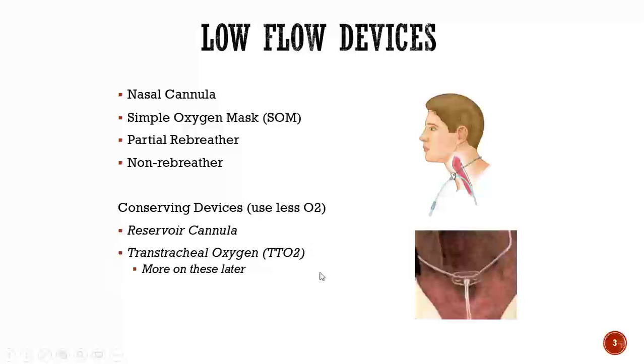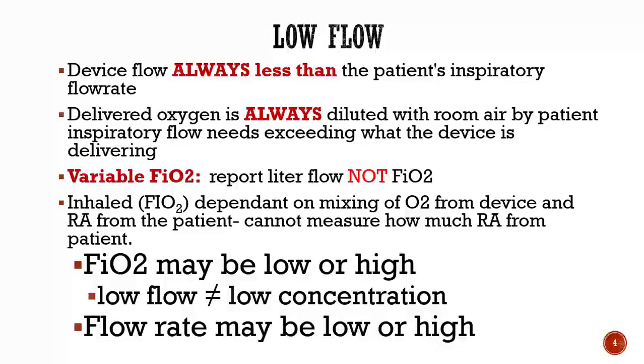Know that there is very, very little on this. I'm not going to ask you about it. This is a very low use device. It's one that still comes up every once in a while for a patient that comes in. I've seen it, but not very often. So that's going to be a small little snippet of this entire lecture. So again, low flow is a device flow that's always less than the patient's inspiratory flow rate.